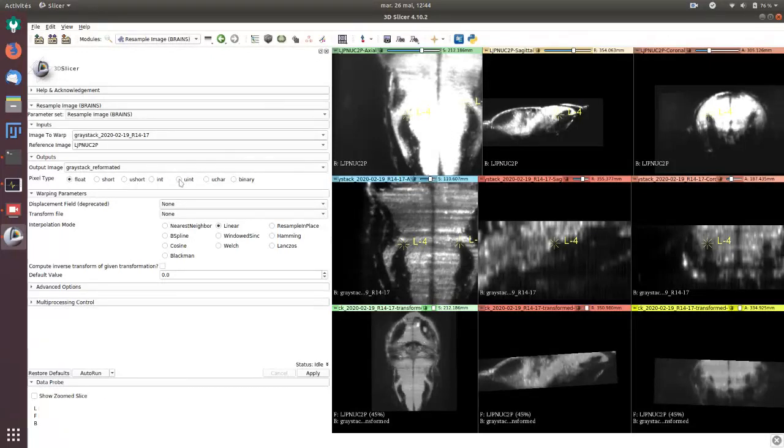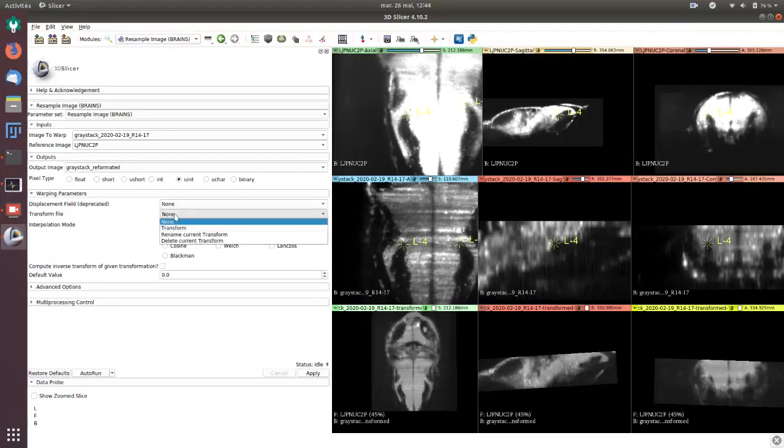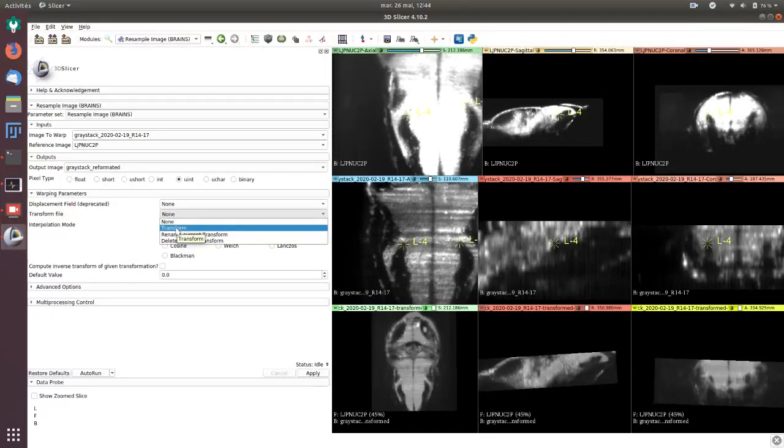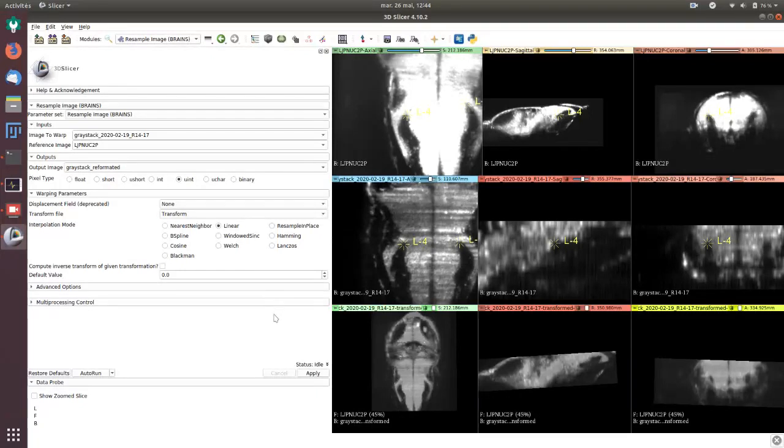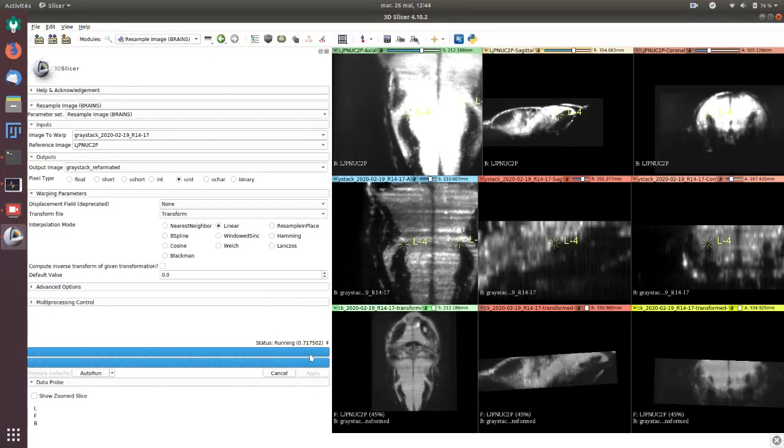I have to choose the pixel type. In input I have unsigned ints so I can keep unsigned ints for the output. I have to choose a transform file which is the only transform file available here, but you can also load the transform file. Once these parameters are complete I click apply and see here if the status is running. If there is an error it will be said here and you can show the detail of the error.